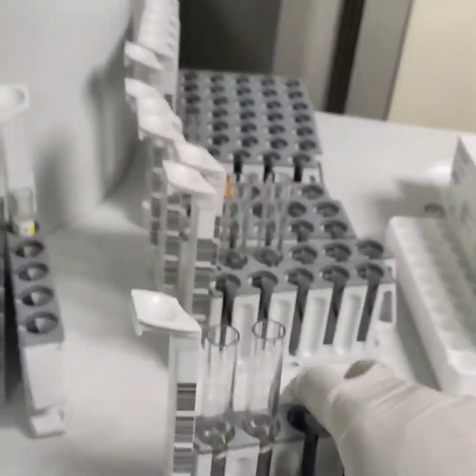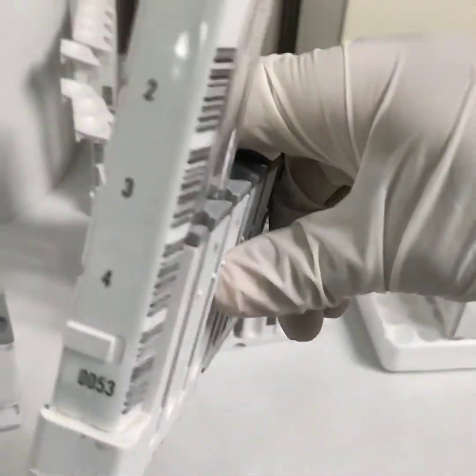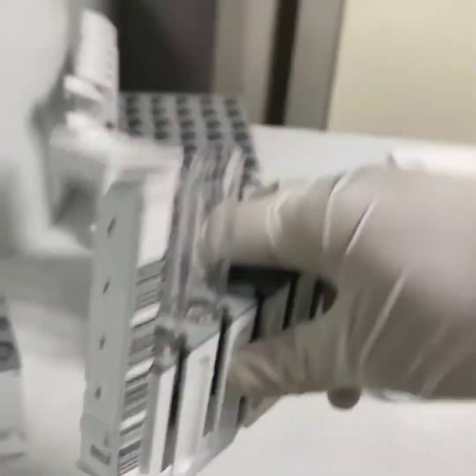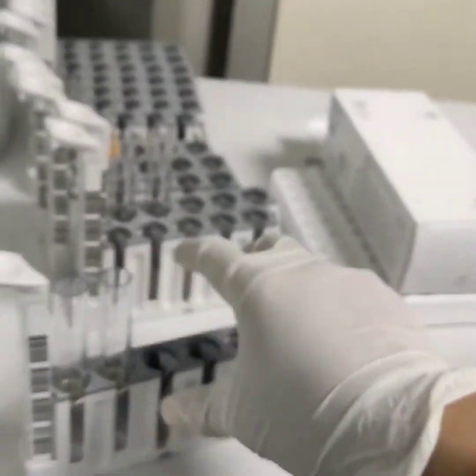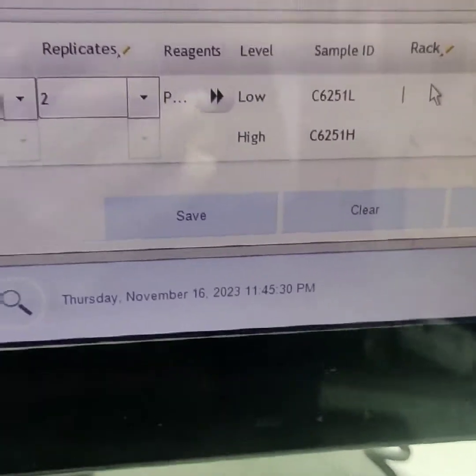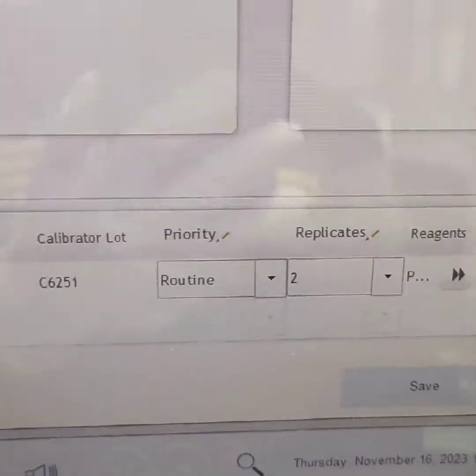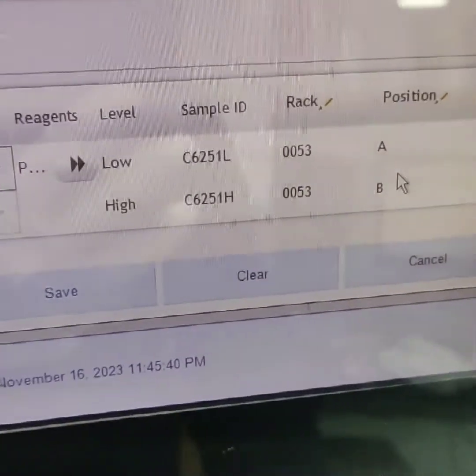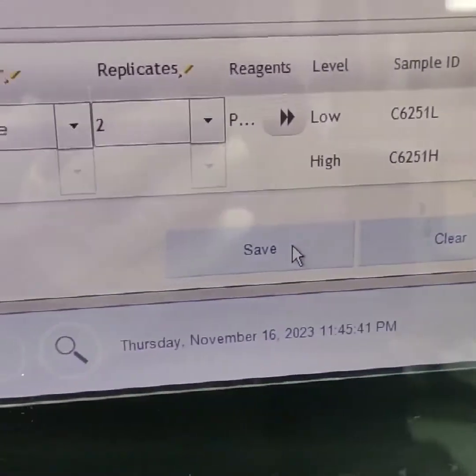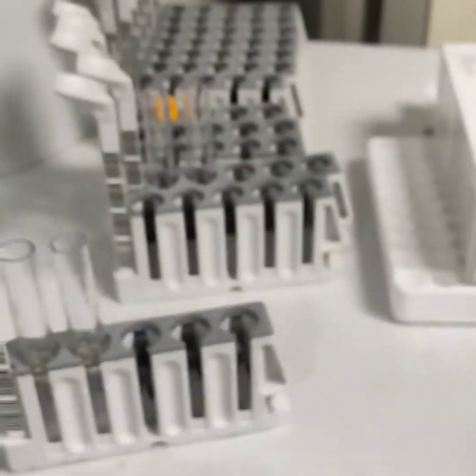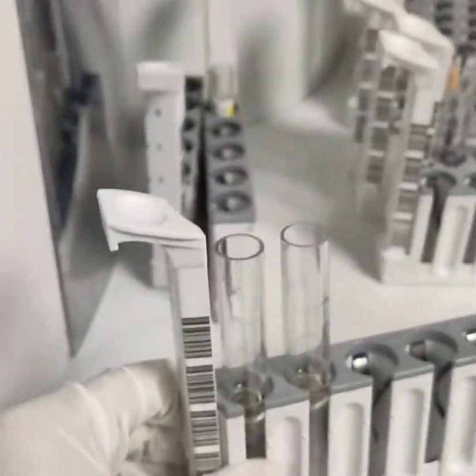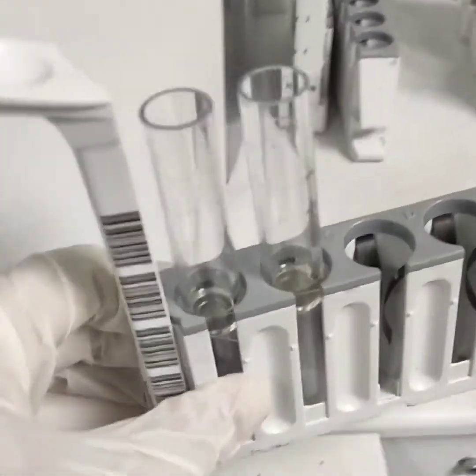Here we need to enter our rack number, which is 0053. We also need to define the calibrator position, which is A and B, and then save our command and begin the calibration by clicking the button along the side of the sample processing route.